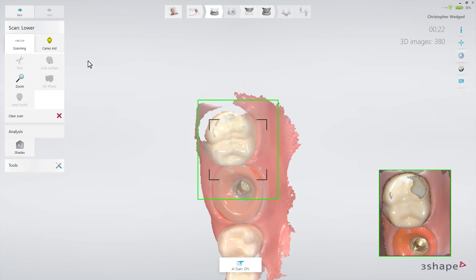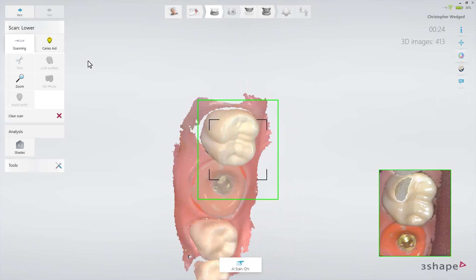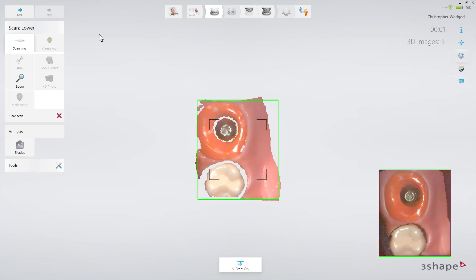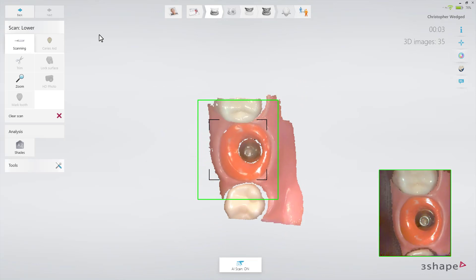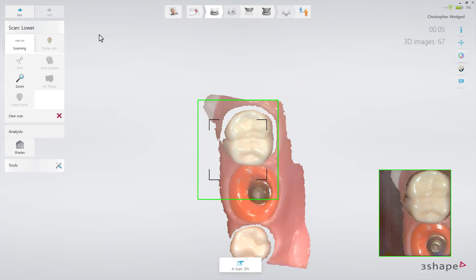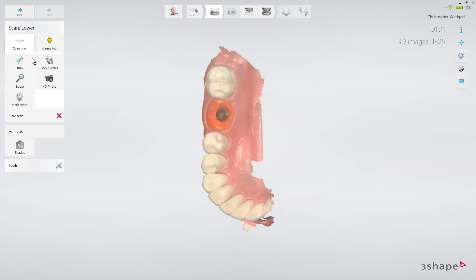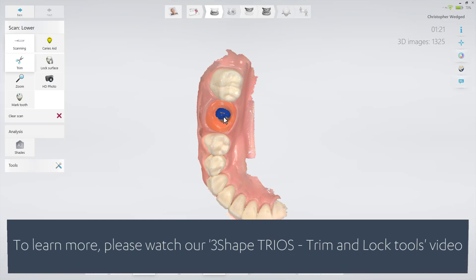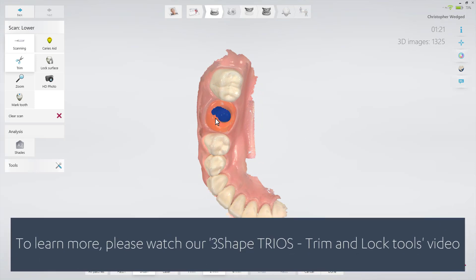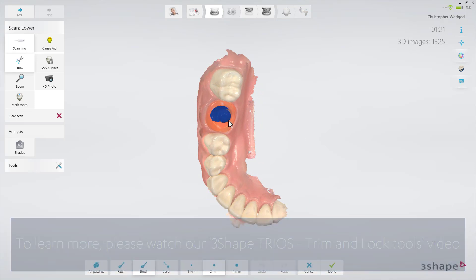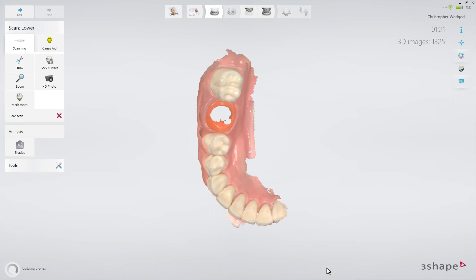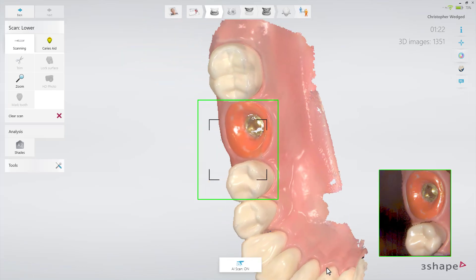Then complete the scan using the official scan strategy. The second option is to leave the healing cap in place and scan the arch following the official scan strategy. Then trim away the healing cap and its immediate surroundings in the scan with the Trim tool. Remove the healing cap, dry the area, and scan the Emergence Profile immediately before the gingiva collapses.